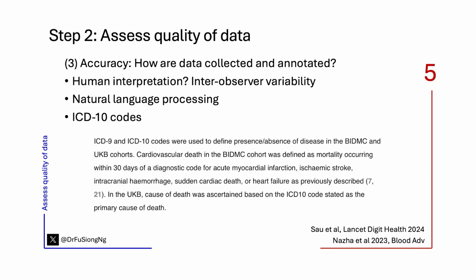Did they use natural language processing? Did they use ICD codes? We know the limitations, all of these things. But again, understand where it's come from, how it's been labeled, and then you might decide whether or not the model is any good. So in this example of ours, our paper, we use ICD codes. So we accept that the coding is not going to be 100% accurate. So there's going to be a limitation in the labeling of the data set that you give to the model to train.